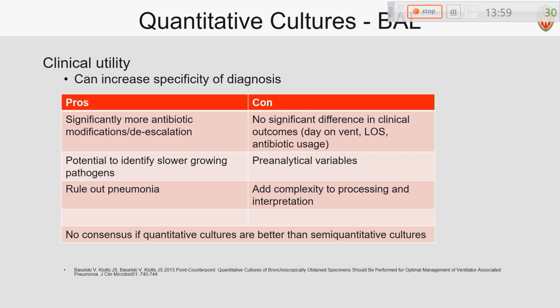A ventilator. I mean, they do it on the seriously ill patients, probably our VAP patients. Do you change the organisms that you would report, or are you still reporting just the potential pathogens? Like, say, if you would get a Viridans group strep that hit the quantity for significant. Again, you could kind of get me in a spot here because I haven't looked at this stuff in a long time, but I think it's specific opportunistic pathogens.